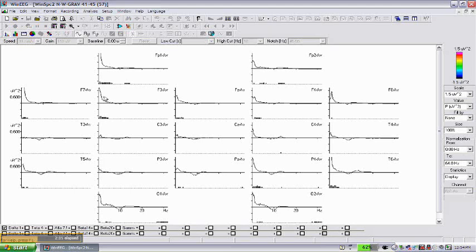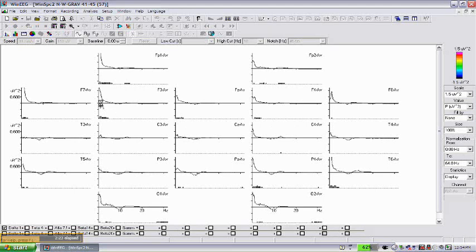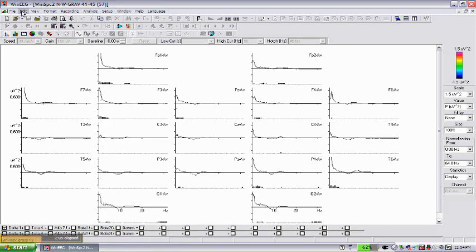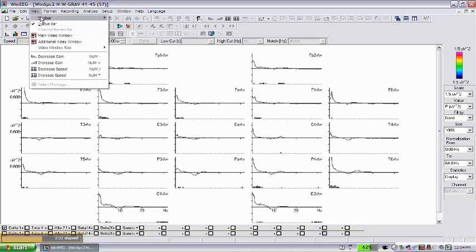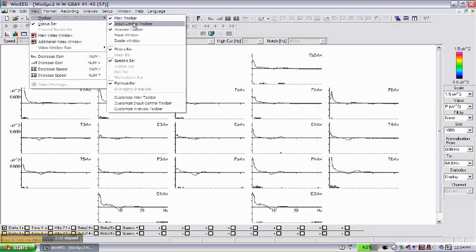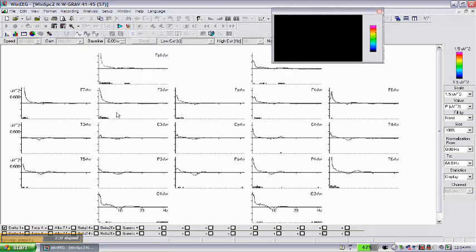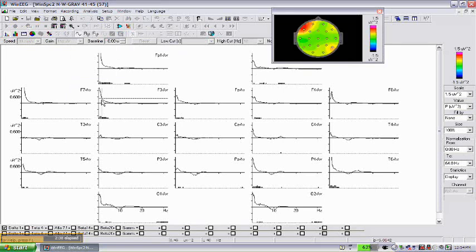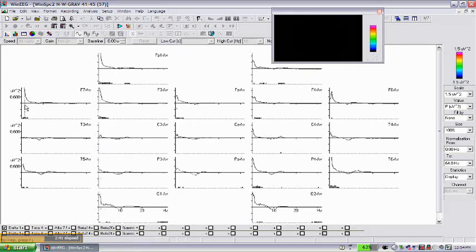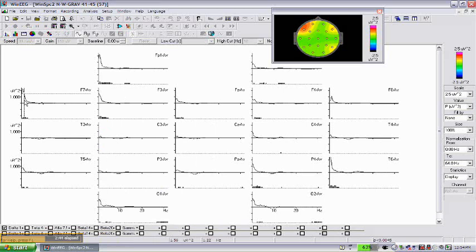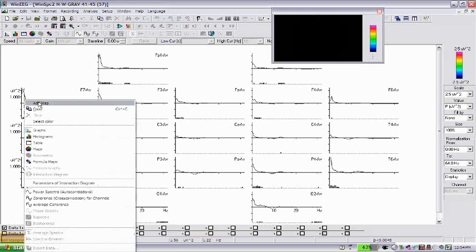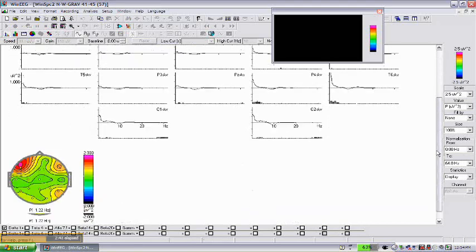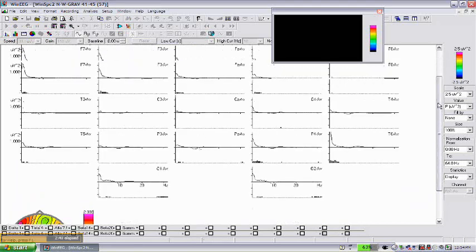So this is the result of this comparison. As you can see in this patient there is an increase of slow activity, and we can map this increase of slow activity. We just need to have the map window.